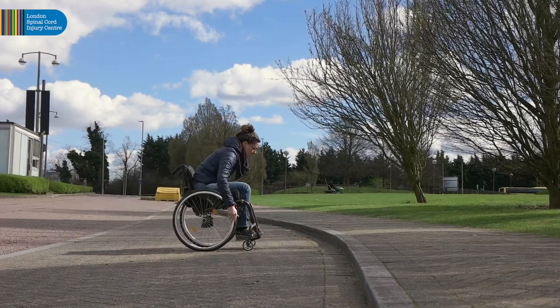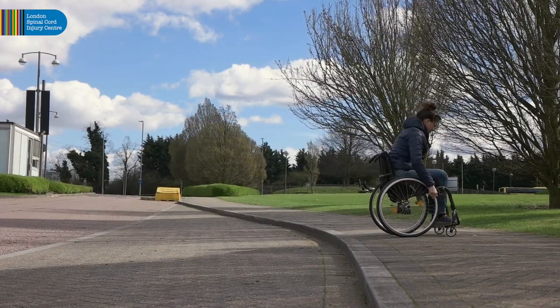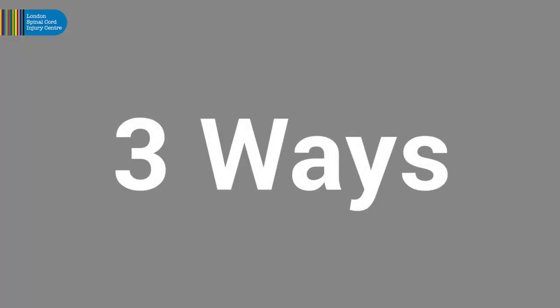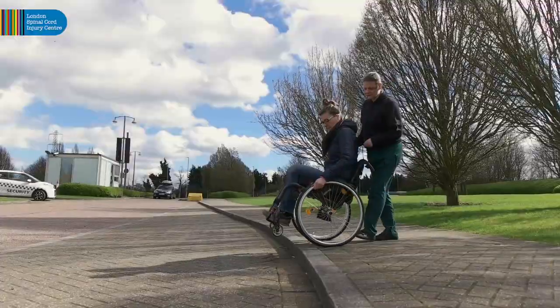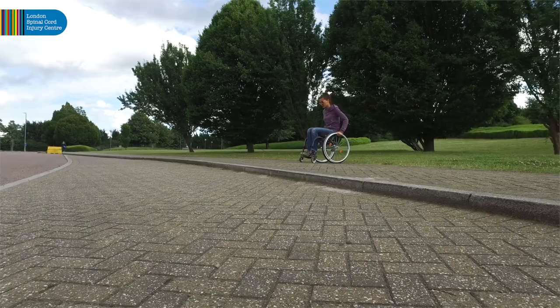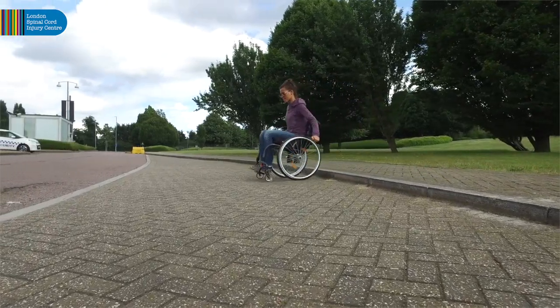The forward momentum carries the wheelchair up the kerb, and if done well, is a smooth, non-jarring motion. There are three ways to descend a kerb: coming down backwards, in a back wheel balance, or by pushing off in a levelled back wheel balance to land on all four wheels at the same time.